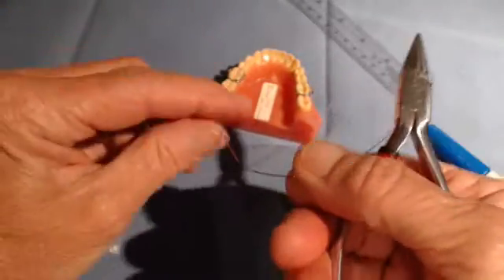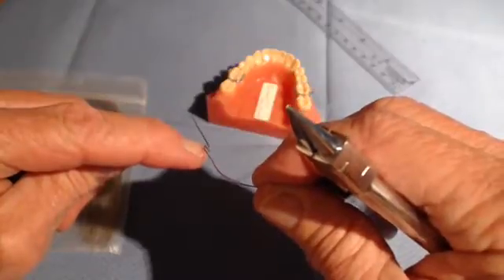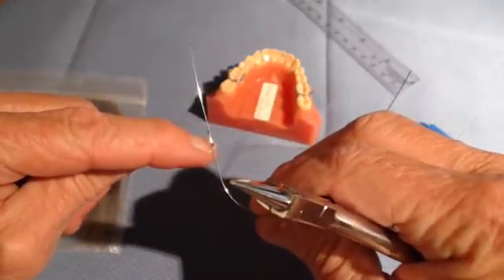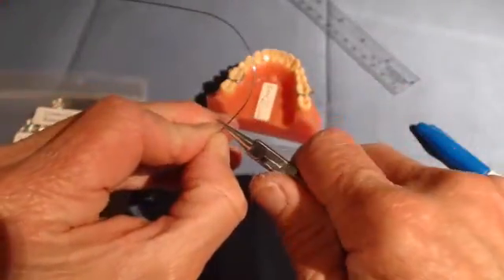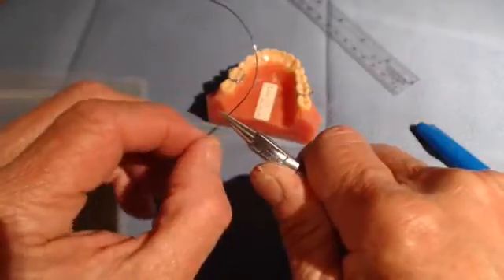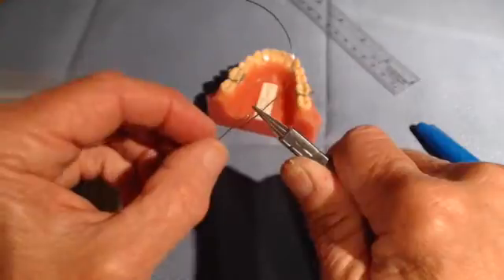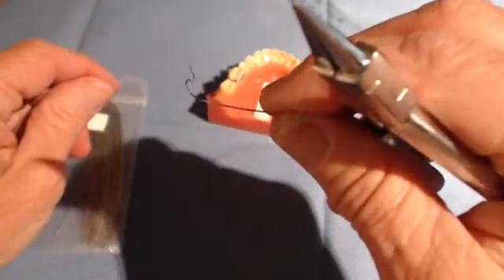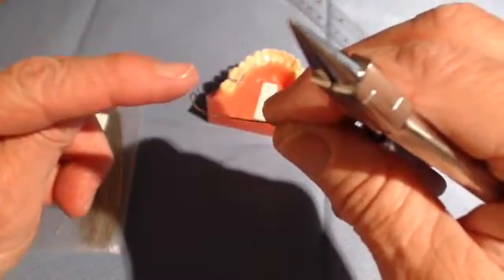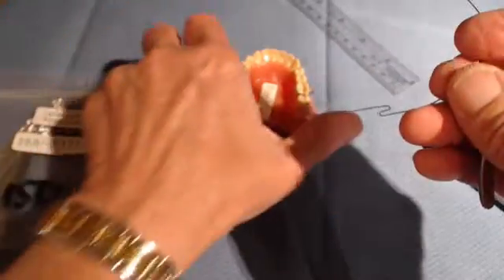Notice how this could exit the tube and impinge on the gingiva below the six. To eliminate this problem, you can place the plier on the wire and, holding it very tightly because it wants to twist in your hands, simply bend the Z-bend toward the tooth and the tube. Now you can see that the bend would exit the molar tube and go buccally instead of straight gingivally. So this side has been completed.